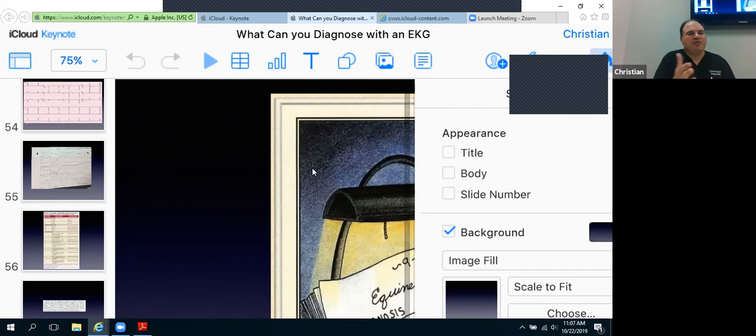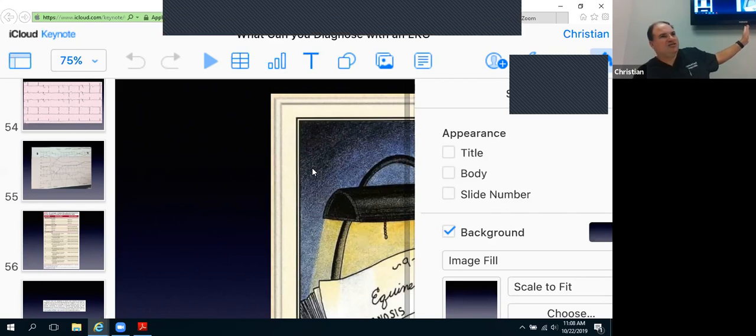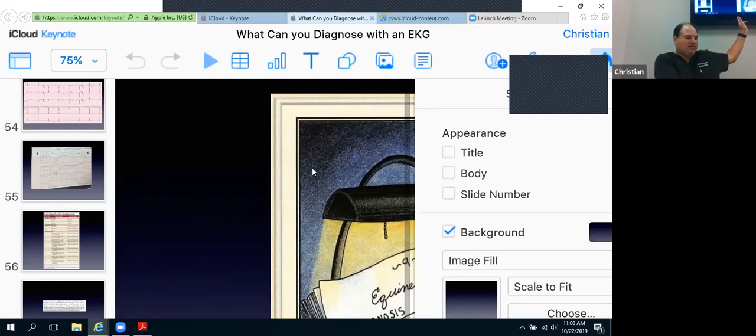In my opinion, it's really like 100, but it's not just my opinion. It's the opinion of a number of other electrophysiologists. But it's more sensitive to say 90, just less specific. So from 90 and above is right axis deviation. From minus 30 to minus 90 is left axis deviation. In general, normal is between minus 30 and plus 90, because minus 30 is like this and plus 90 is like this. So your depolarization of the R wave should be going like that.